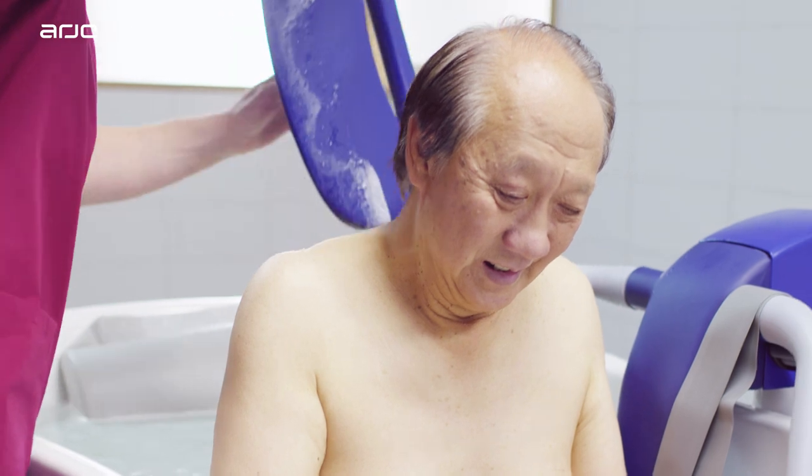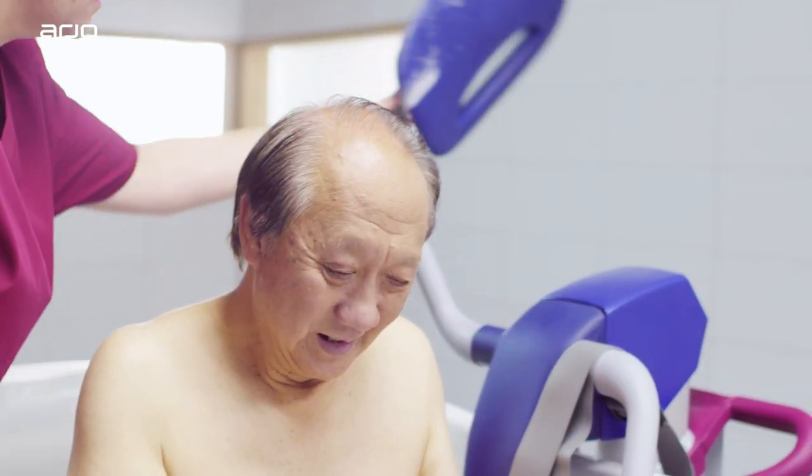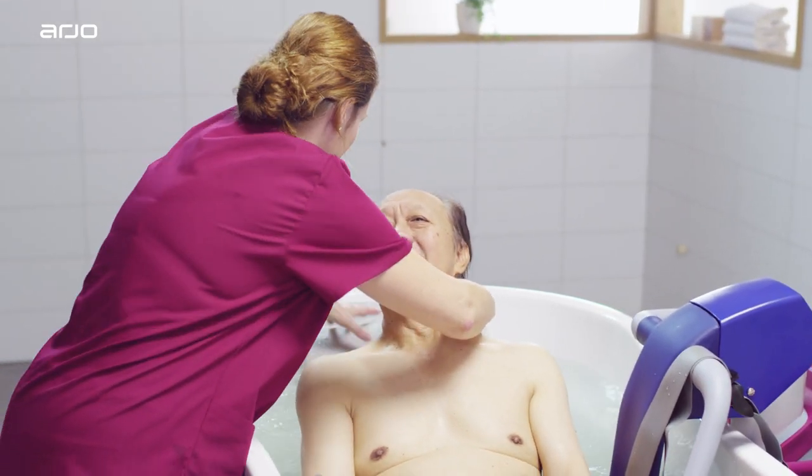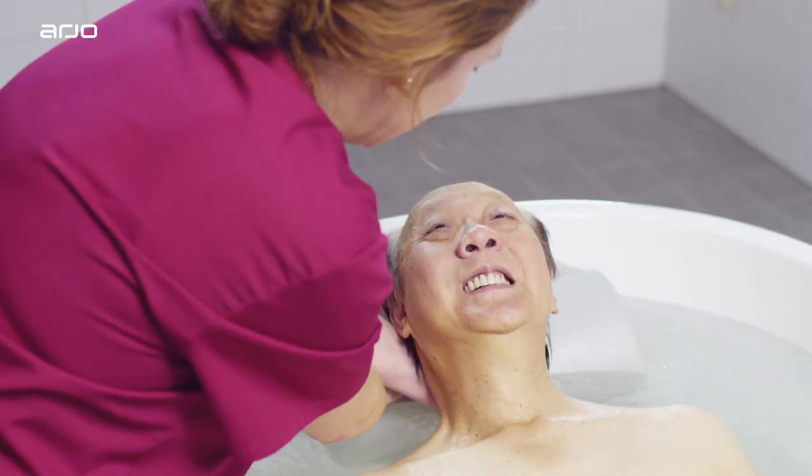If the resident prefers and is capable, the backrest can be folded away. This will allow the resident to recline against the back of the tub and the pillow. A foot support can also be attached.